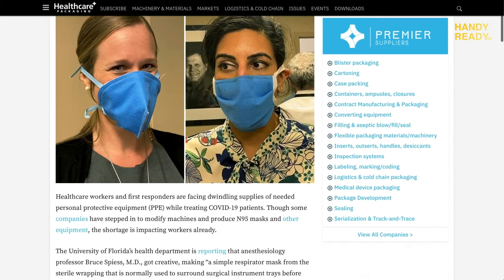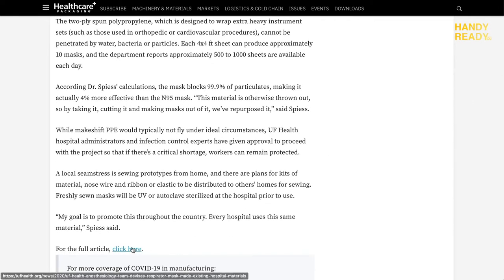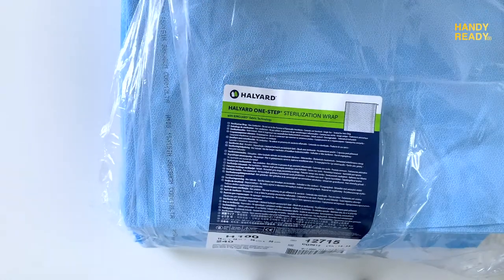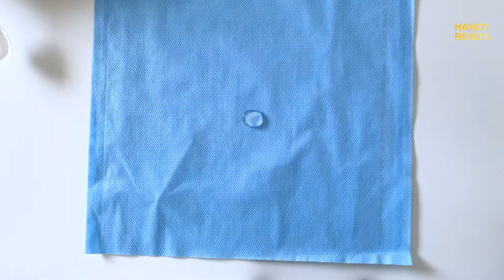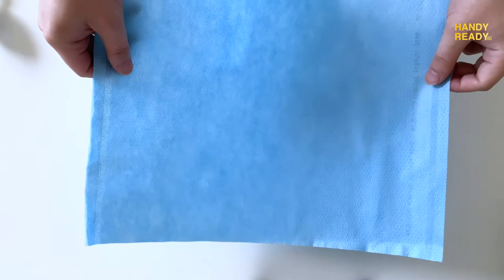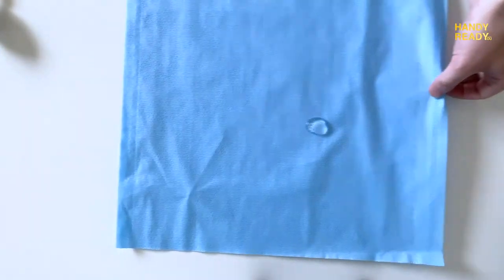In fact, many hospitals are using sterilization wrap to make disposable masks. We are going to use it as a filter instead. The one I'm using is Halyard H100, 15 inch by 15 inch, made in the USA — it is the thinner wrap in the product series. The thicker one, such as the H600, is commonly used in hospitals as a DIY mask, but we don't need it for our case. You don't have to get the exact brand — just make sure it is a sterilization wrap in double layers and you're good to go.